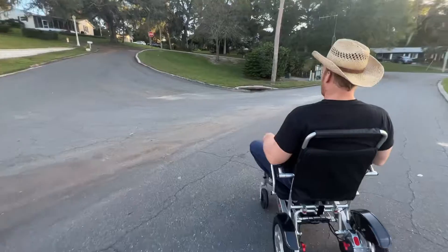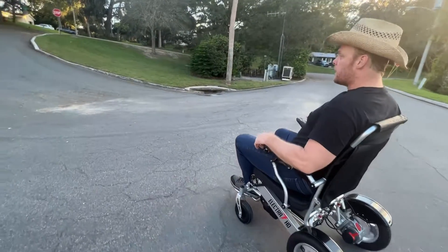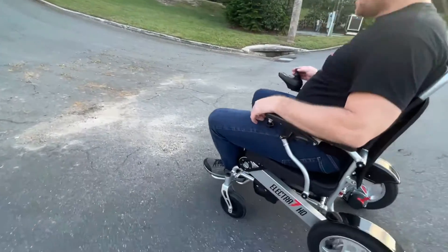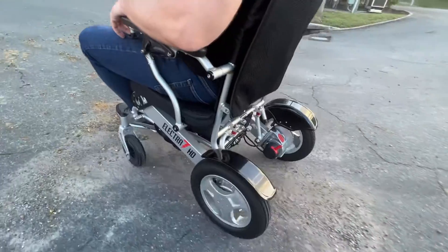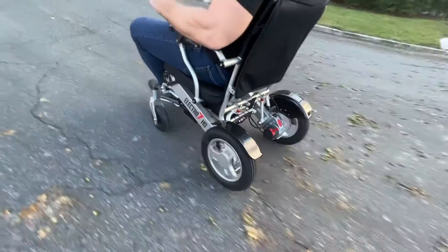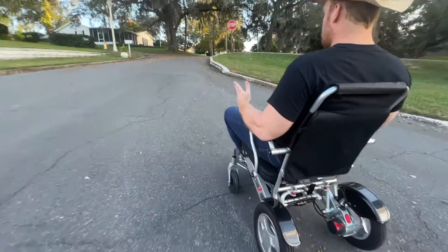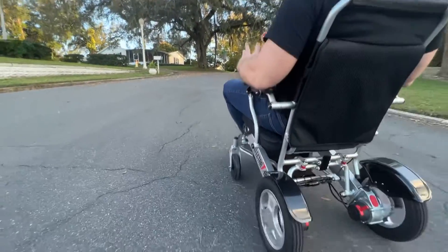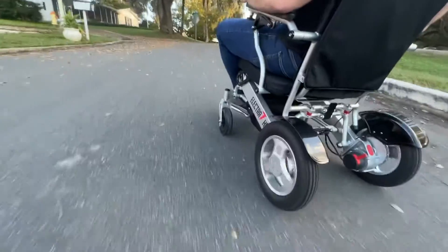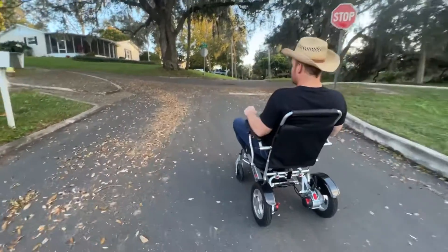Two 250-watt motors. Going into my first very uneven area here — I am not giving it full gas. Right through some of the worst areas, I have acorns. The chair doesn't even flinch with the acorns. I am keeping the joystick straight up. Now if I give it some gas, I can accelerate and go pretty fast. I am not really having a difficult time at all. Going up, of course, is easier than down.